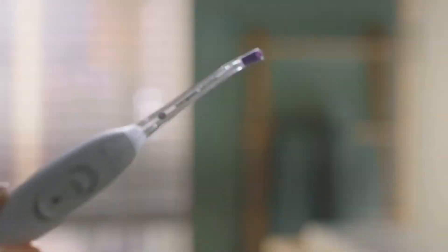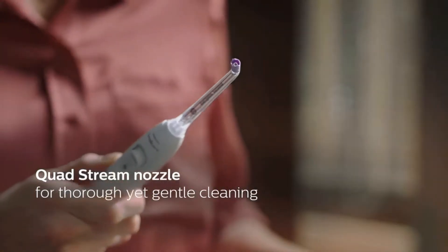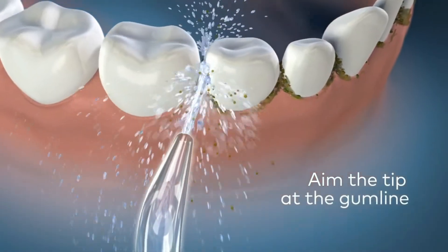Water flossers leave teeth with that clean, just-left-the-dentist feeling. In today's video we're going to check out the best water picks of 2022.